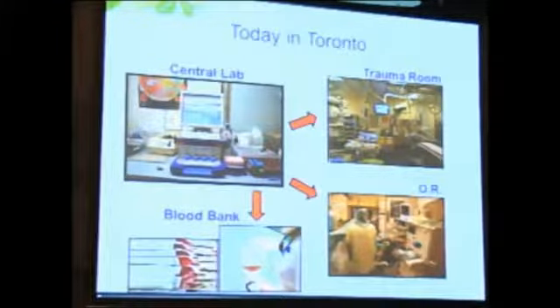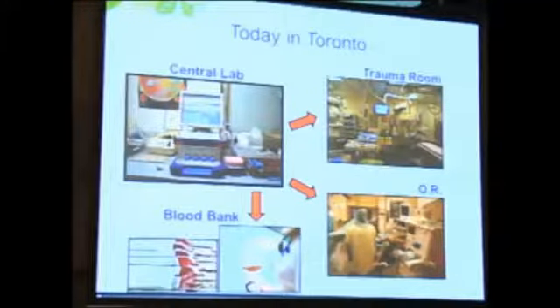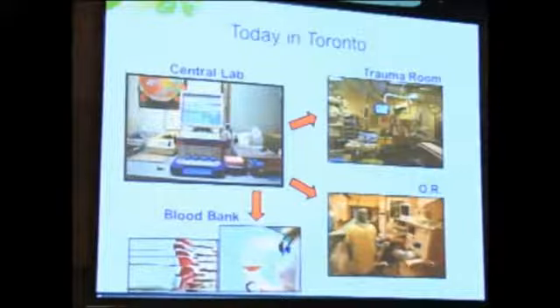Automatically, as soon as the machine turns on, the screen in the trauma room turns on, and whoever is resuscitating the patient just looks on the screen and says, look, the A5 is below 35. Guys, call for platelets, call for fibrinogen. Or they see the patient has excessive fibrinolysis, they say, forget it, this patient has to go to the operating room now. Okay? So it really helps us with that.